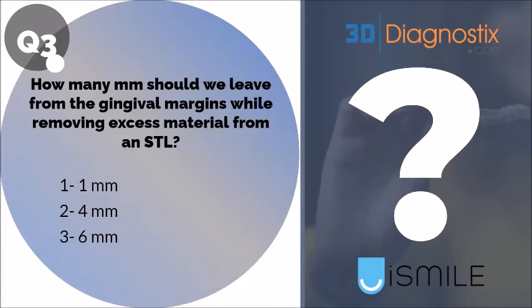Why? Because while removing the excess materials and borders from the STL or the edges, we need to keep around 2 to 4 millimeters of gingiva and mucosa around each tooth to avoid what we call gapping or snapping of the gums during the tooth movements. So 4 millimeters is the correct answer.